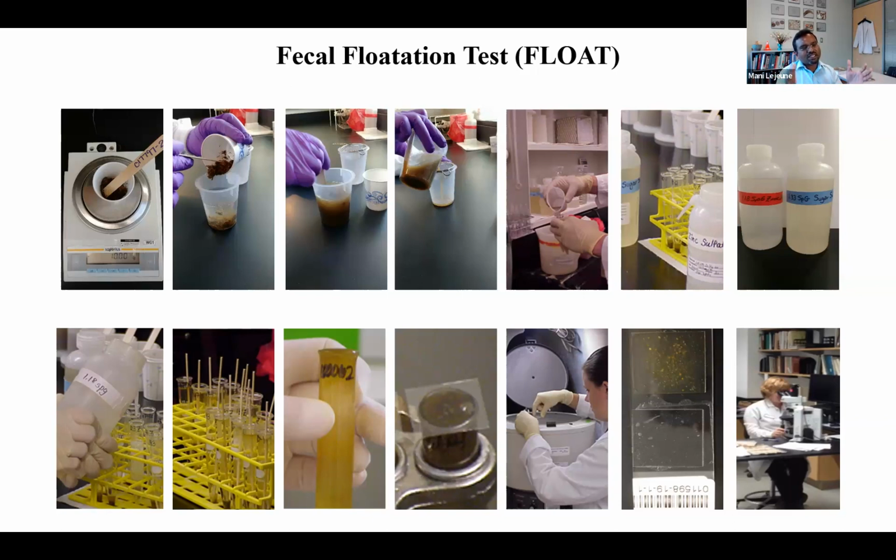So taking a 10 gram sample and then homogenizing it in water would help us disperse those parasite stages which are concentrated in one pellet. For that reason, we need at least 10 gram to get a meaningful result. And folks, if you don't have a way to weigh 10 grams, one thing to keep in mind is that we usually assume that a gram of feces displaces about 1 milliliter of water.